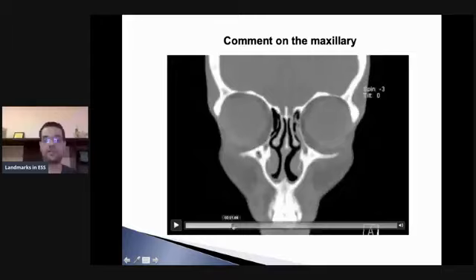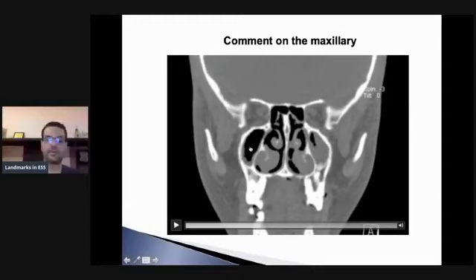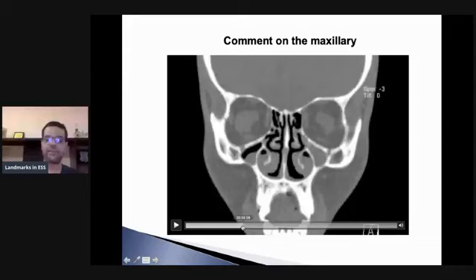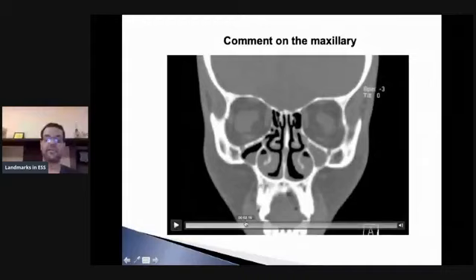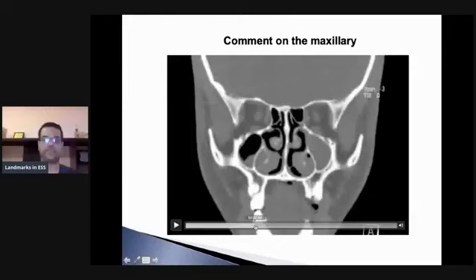The reason is you see the symmetry of the sinuses on both sides. So you tend to forget that this patient has a hypoplastic maxillary sinus, and you just focus on the disease in the maxillary. And how did I know that the patient has a hypoplastic maxillary sinus? By looking at the floor of the maxillary in all the cuts. You see in all the cuts, the floor of the maxillary sinus never crosses below the line of the floor of the nose, this horizontal line. And when you see this in all the cuts, you understand that this patient has a hypoplastic maxillary sinus, and in this example on both sides. Now, going to the sphenoid.